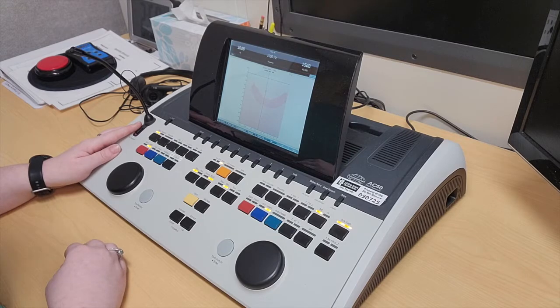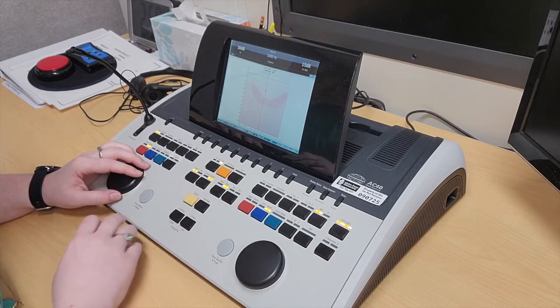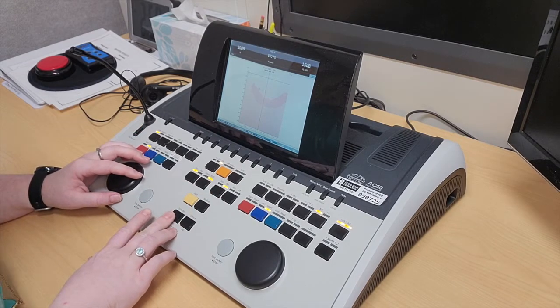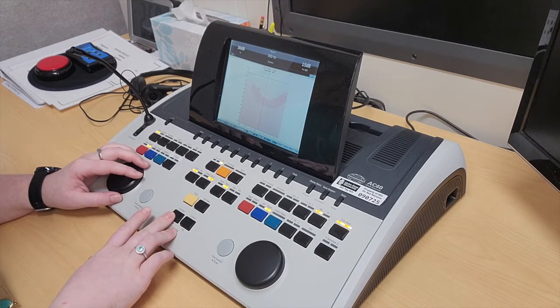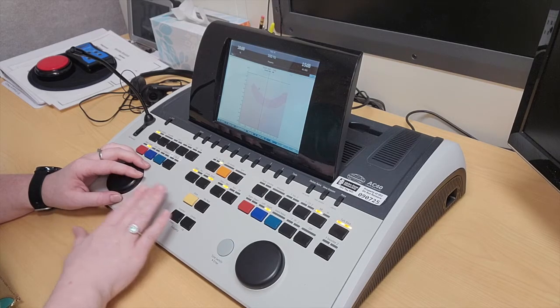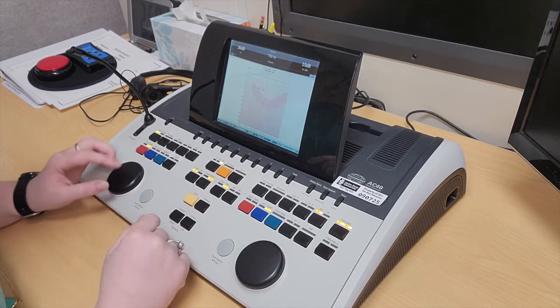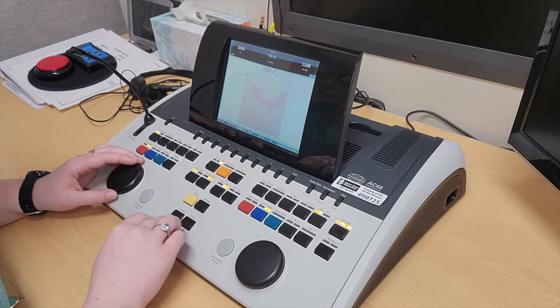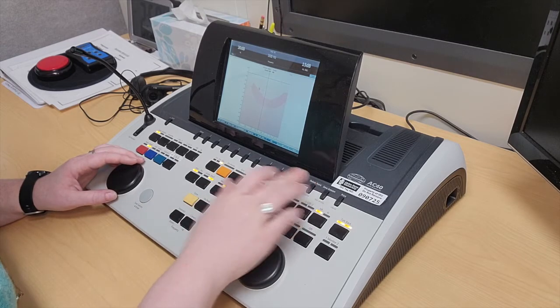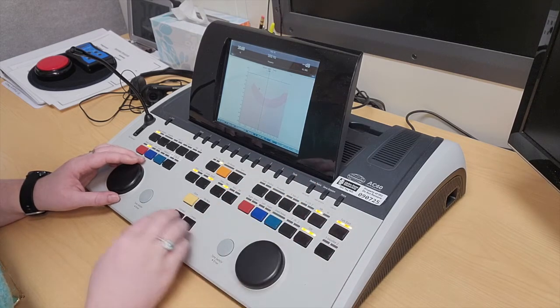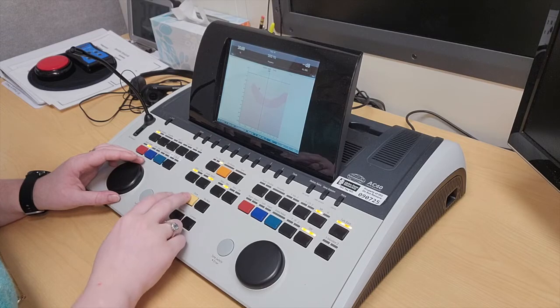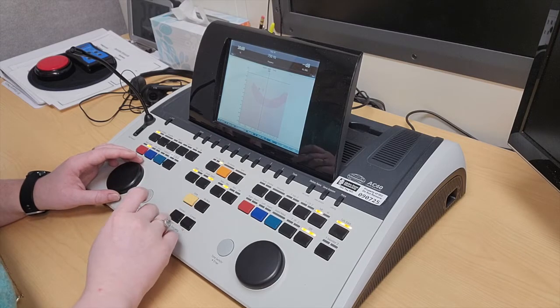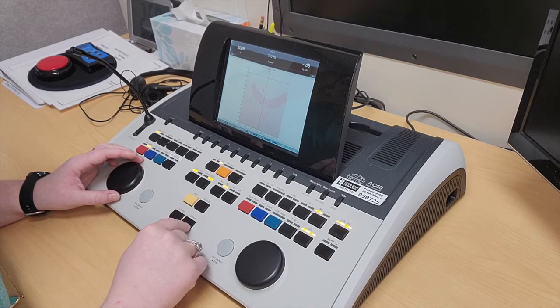Pure tone average calculations: that is 500, 1000, and 2000 Hz. If I put the marker here and press store, that's at 30 dB at 500 hertz.